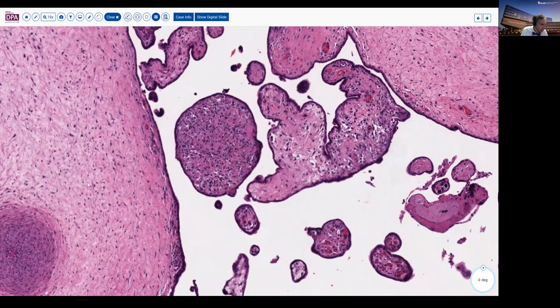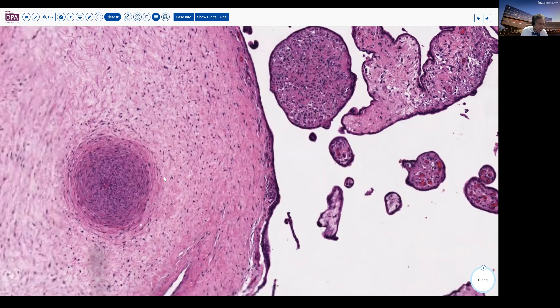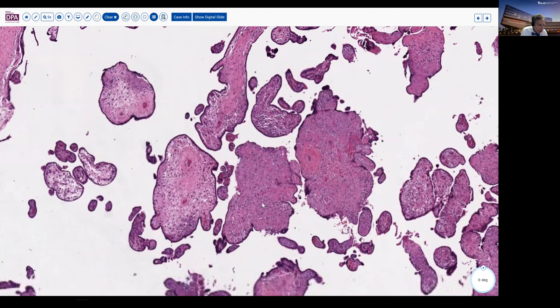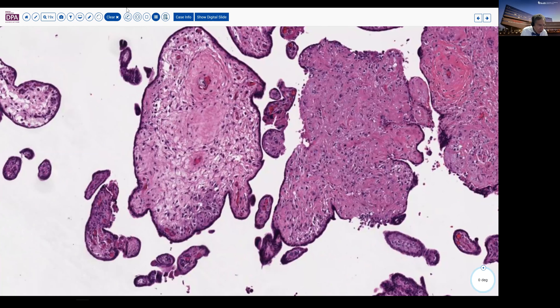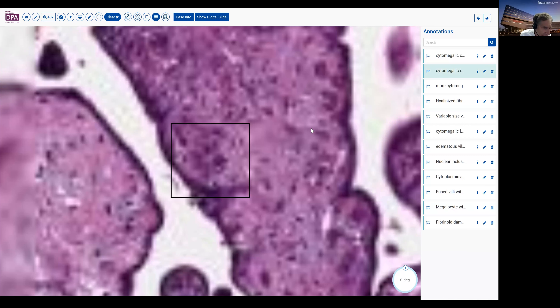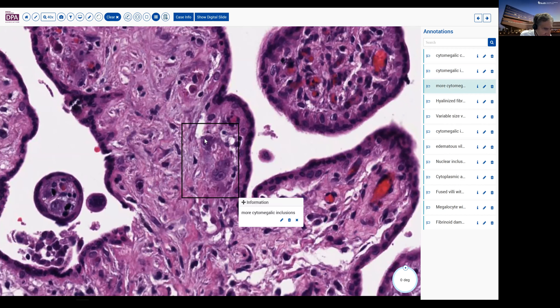So that's essentially what we're going to be seeing with this type of infection. The clue, of course, is to recognize at low power the abnormal architecture of the placental villi, then go to higher magnification in search of the viral inclusions, which should not be difficult to find. And here's one right here — it shows up quite nicely. A nice cytomegalic inclusion. We can see a nice eosinophilic inclusion in this cell as well as in this cell where we see the stromal features.